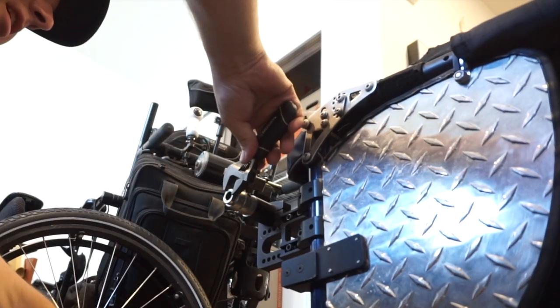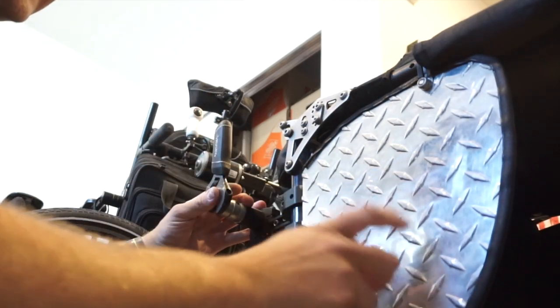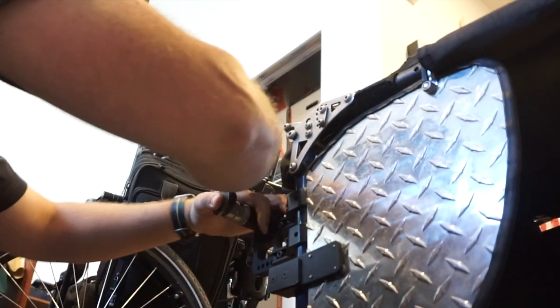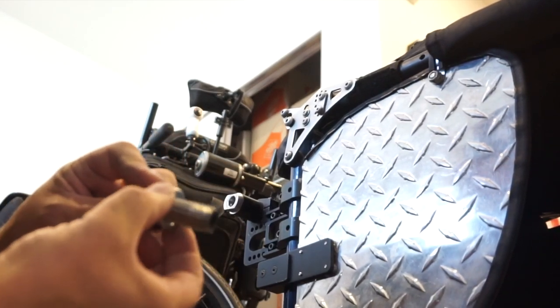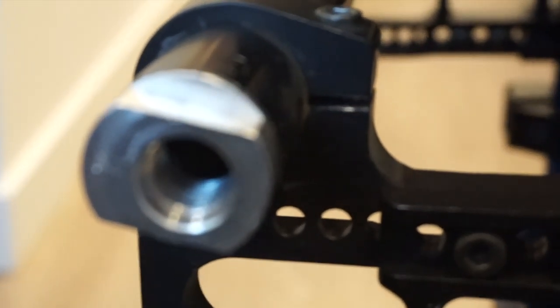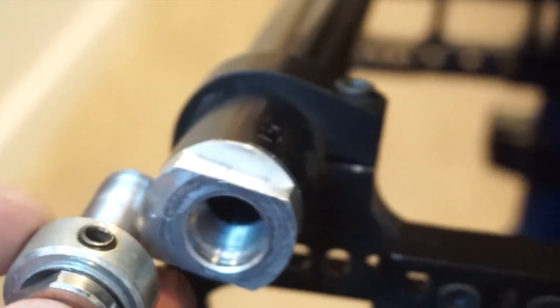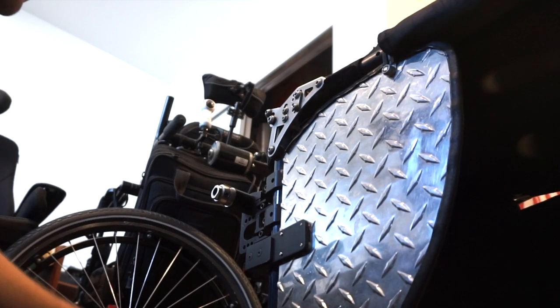This is a TiLite titanium chair, so it's pretty lightweight. I haven't weighed it but I can pick it up and move it around pretty easily even with the side guards. I custom made those as well. Same deal on the other side — taking one spacer off. You can see how long the threads are on this, and looking inside the camber tube the threads don't go that far in. I got upgraded chromoly axle tubes — the old black anodized steel ones broke, but these chromoly ones are way stronger.